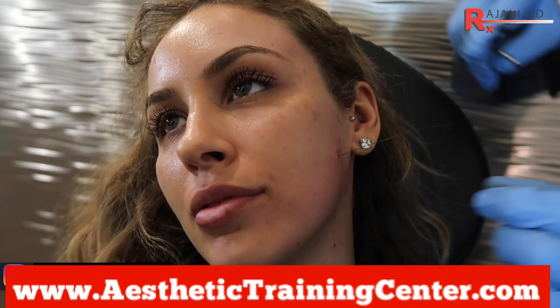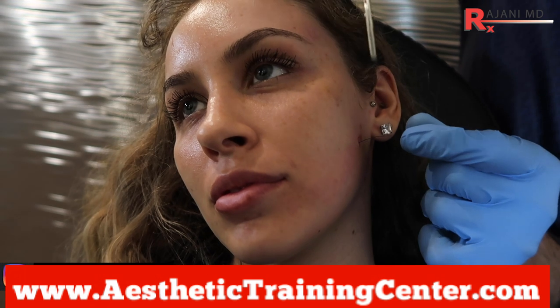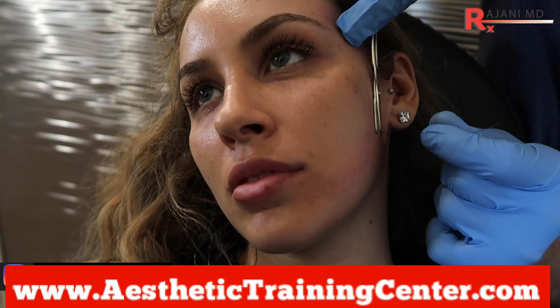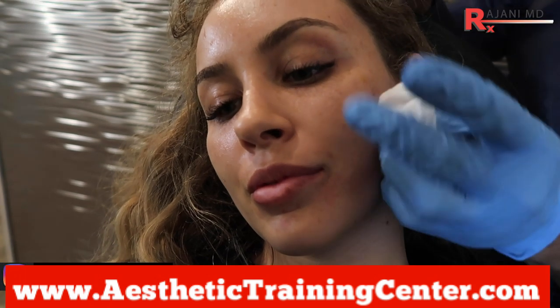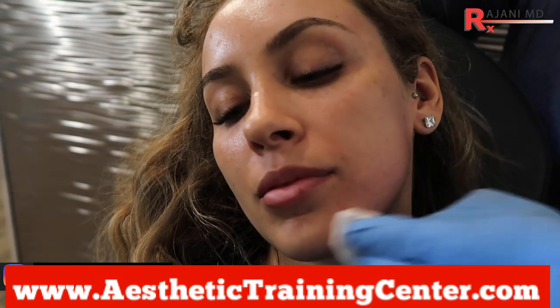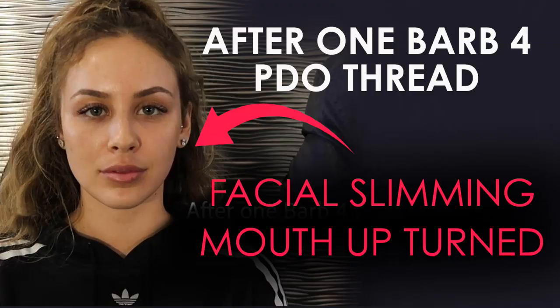I'm going to engage the thread — you can feel it go click click click click click. Sometimes the patient can feel it engaging. Smile again — this looks perfect. If you saw an irregularity, that's the time to address it. The key to burying the thread is to hold it using only the tip, push down on the skin, and clip the thread — don't clip the patient's skin, I've seen that happen. Bury the thread. That's one barb4 Nova Thread PDO placed to lift the edge of the mouth.